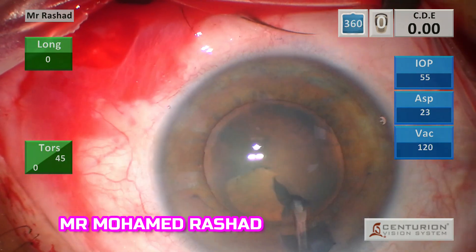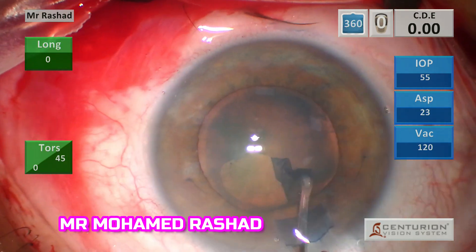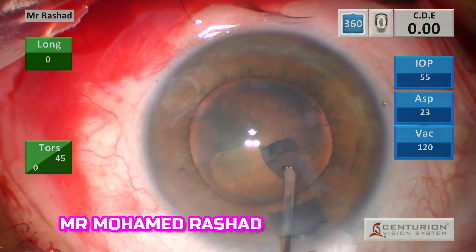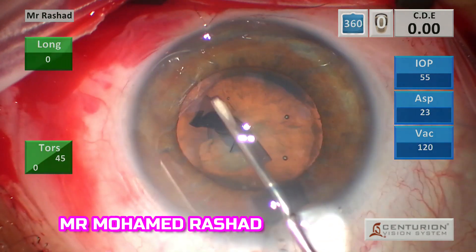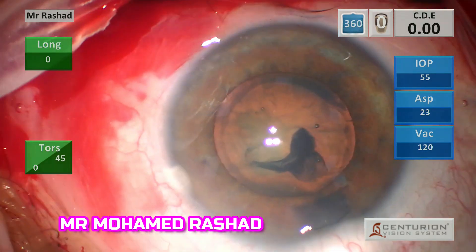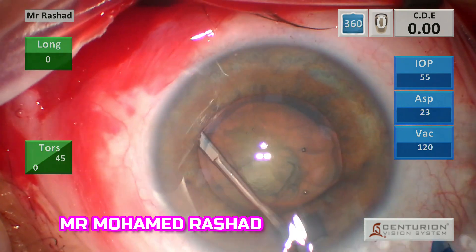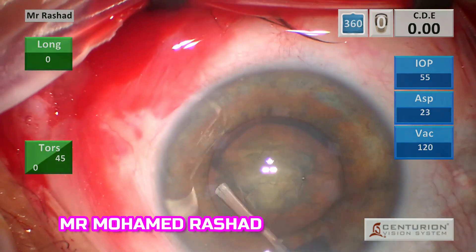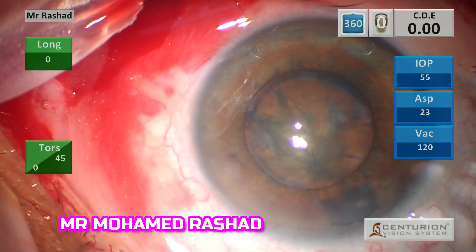This is my capsulorrhexis technique as discussed before. I usually start at about 2 o'clock and then go anti-clockwise with the cystotome on the Healon cannula to maintain the anterior chamber depth until we complete the capsulorrhexis. Then we do hydrodissection, depressing on the nucleus to see the fluid wave anteriorly.